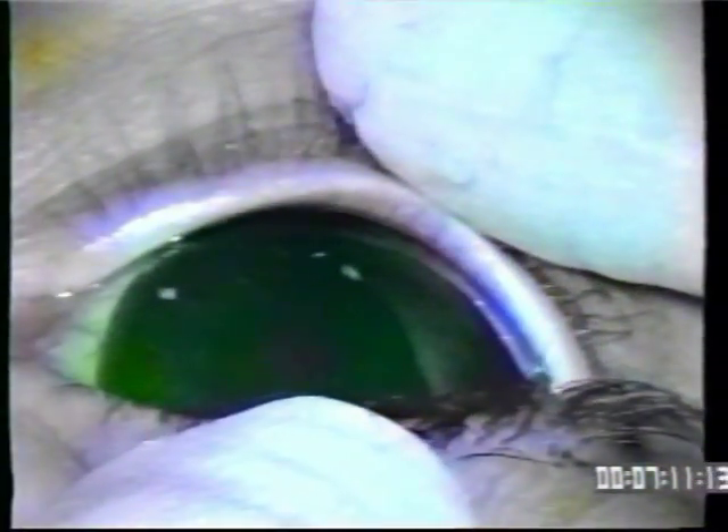Demonstrating the contact lens that protects the cornea — to take it out, you just break the vacuum and out it comes. We must protect the eye when doing procedures over the eye. If you want to see if the eye opens and closes, take the contact out. Notice how the patient lying down with the gold in — the eyelids come together.